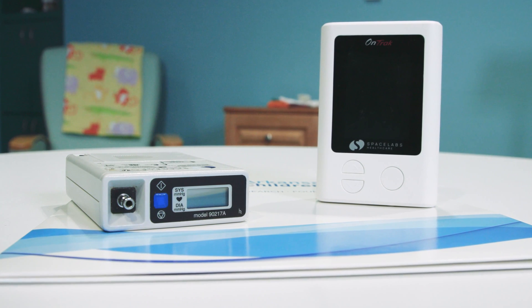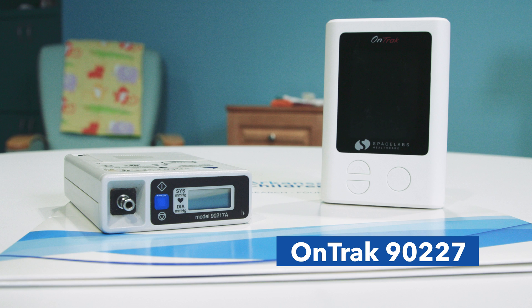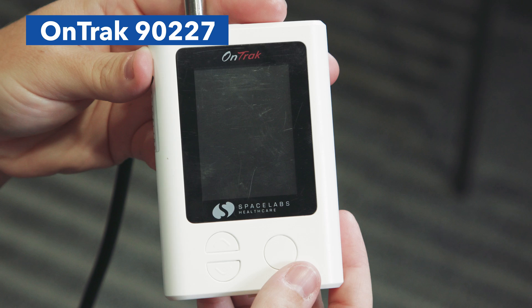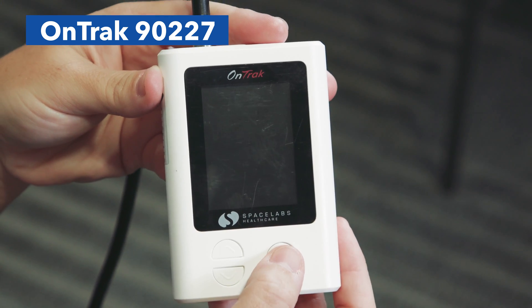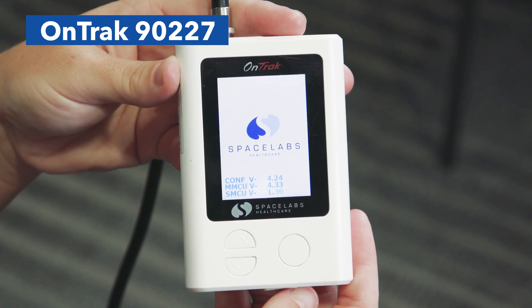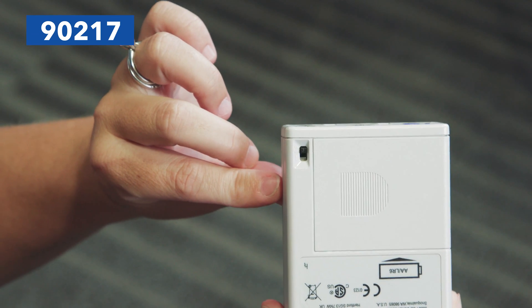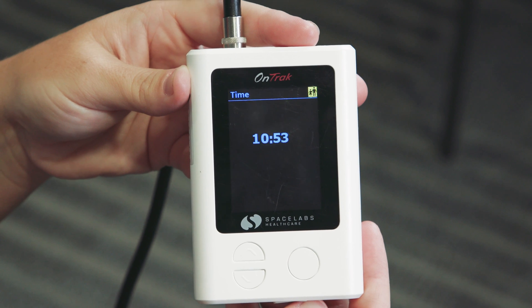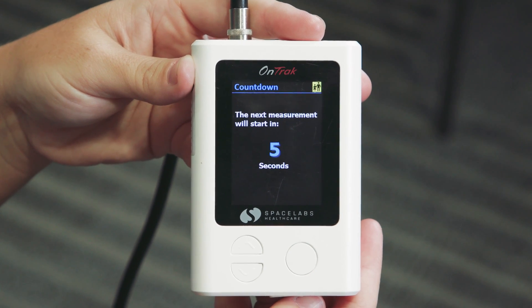Our clinic uses two different monitors. You'll either receive the OnTrack 90227 or the 90217. The nurse will let you know which one you will receive. On the OnTrack 90227 monitor, press the round button one time to begin the test. On the 90217 monitor, press the blue button one time to begin the test.